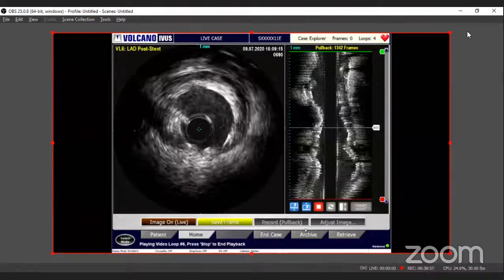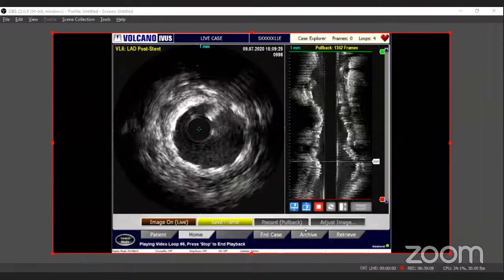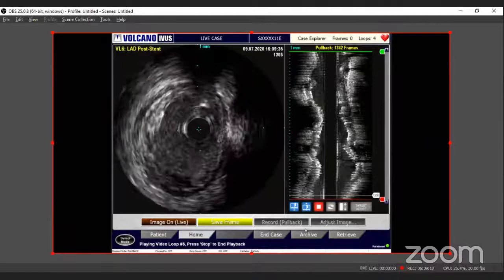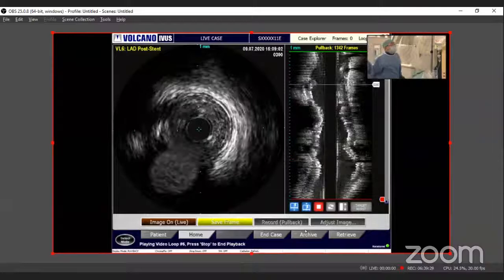The other things you want to look out for post-PCI would be expansion and apposition. So how well the stent is expanded compared to the reference segments and whether there are any struts hanging. There was none of that. This is already in the left main. You can see that there's still disease in the left main, obviously. But where we have landed, we haven't caused any trauma to the plaque, so there's no dissection. And it was all very well apposed throughout. I don't think we will do IVUS of the Cx because of the angle, the IVUS catheter is not able to cross.